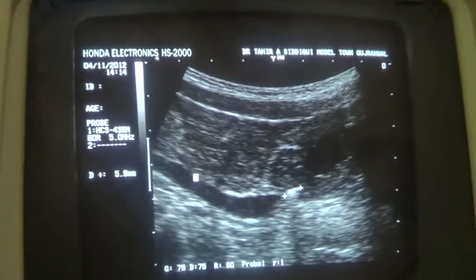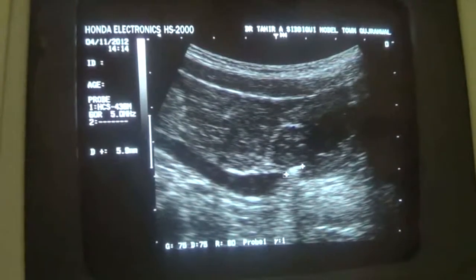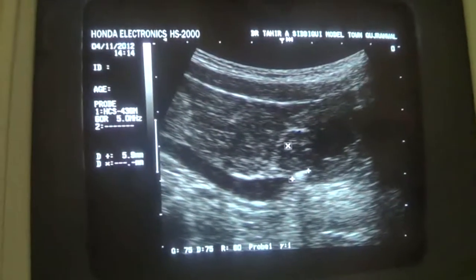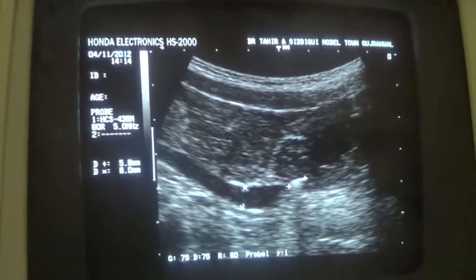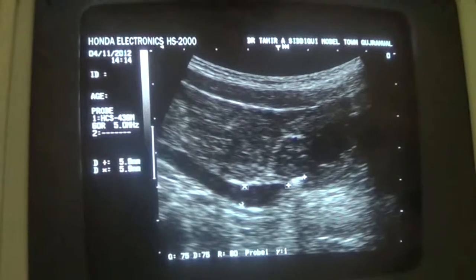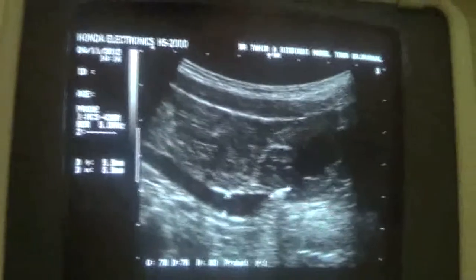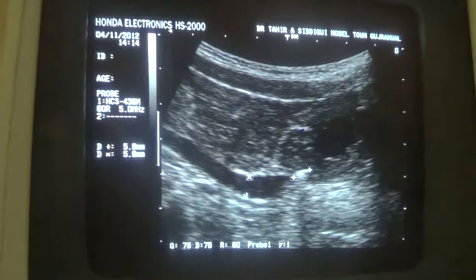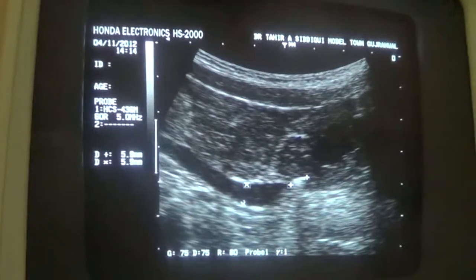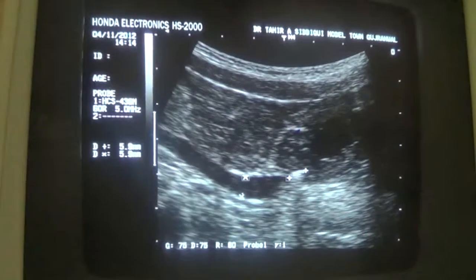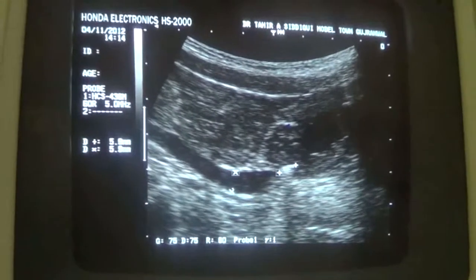This is the right distal ureter, dilated to approximately 5.9 mm. So this is a case of right obstructive uropathy due to a calculus in the most distal end of the right ureter. Thank you.